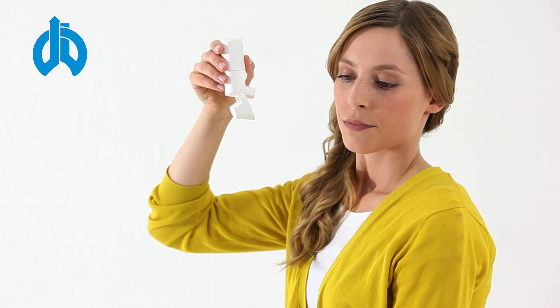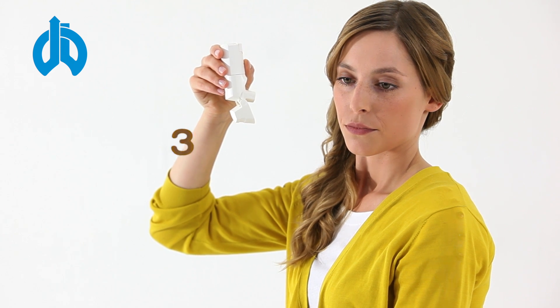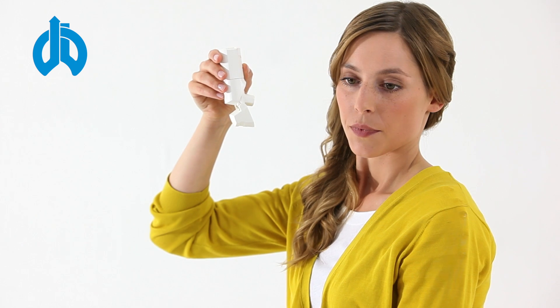After inhaling, please hold your breath for 5 to 10 seconds. Thereafter you can breathe out slowly but not into the inhaler.